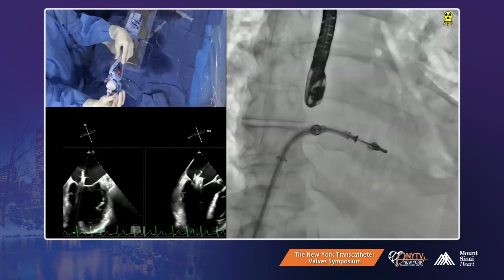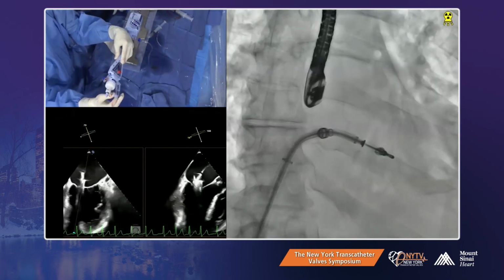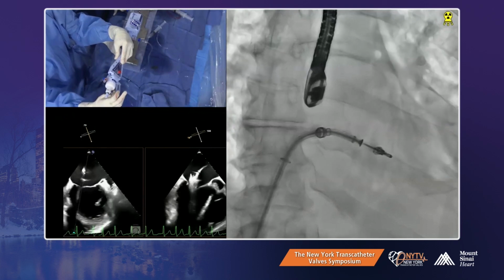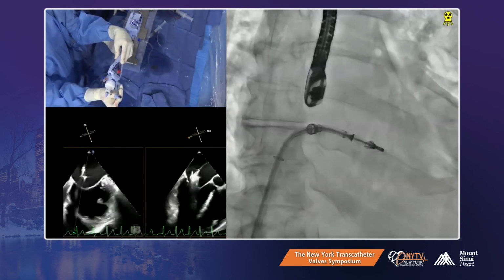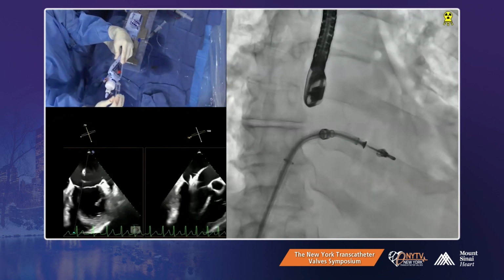So we're going to drop the tactile down. Okay, what is it? Can you show us? I think it's posterior. Can you show us posterior, please? Yeah, there you go, posterior. Everyone agree? Posterior. Okay. Tactile is posterior. Non-tactile is anterior. Yep. Everyone agree? Yes. Very good.